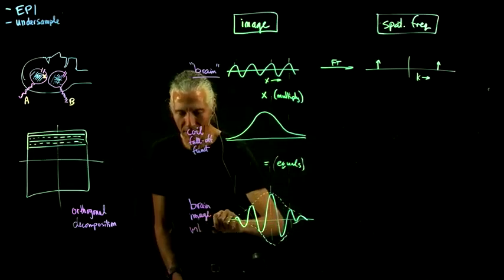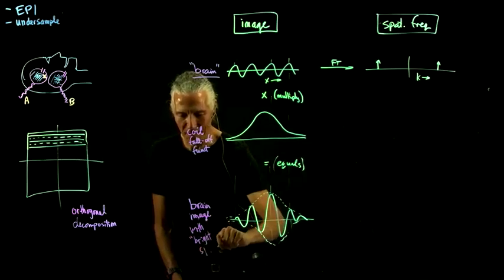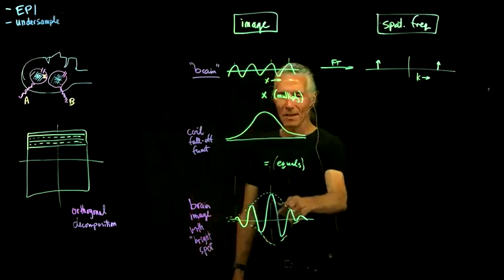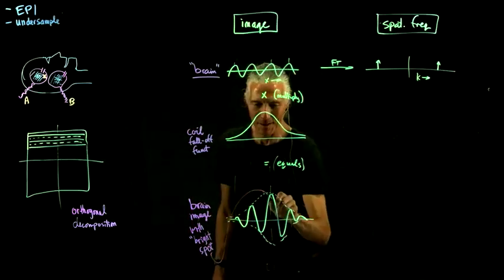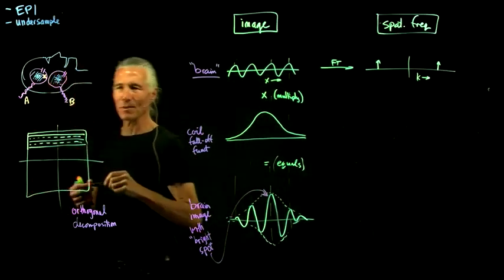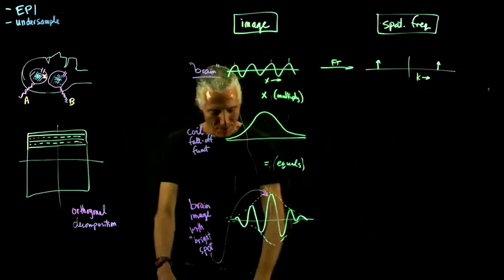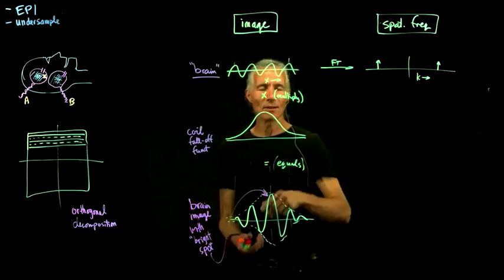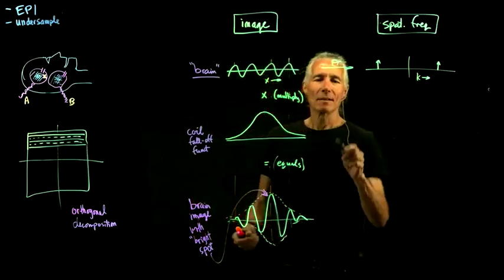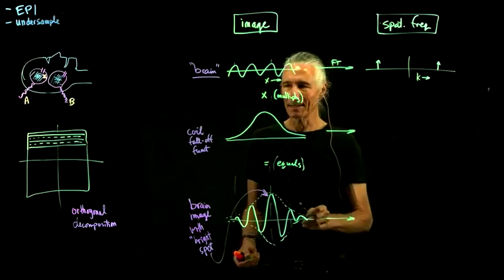With a bright spot. And where's the bright spot? Like in the middle of the coil. So here's the bright spot right there, right in the middle of the coil. Okay, so that wasn't very informative so far, but now let's go over to the Fourier domain to see what it's doing over in K-space.